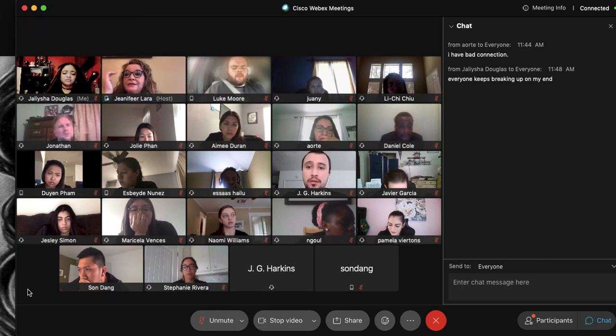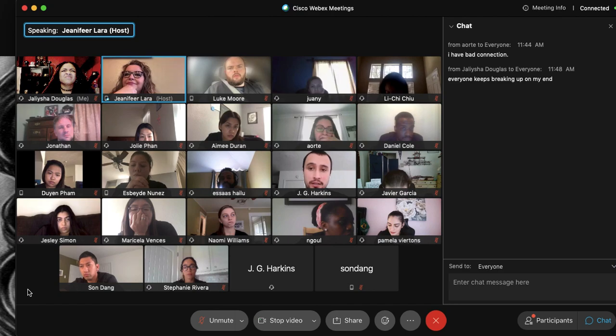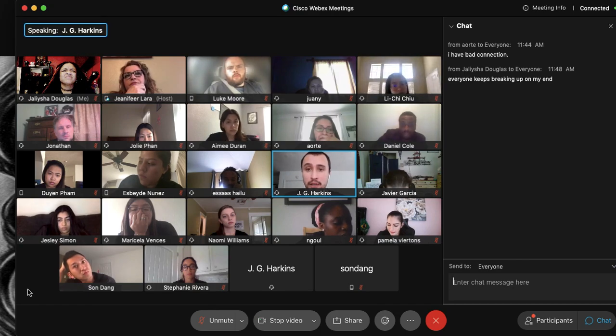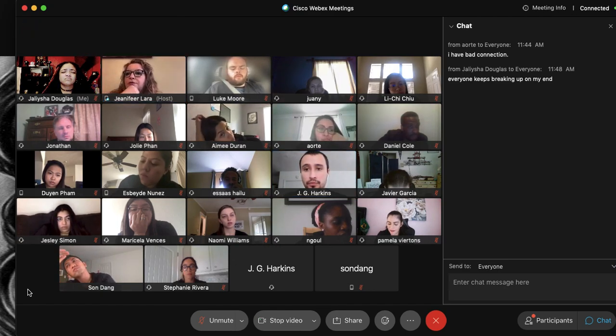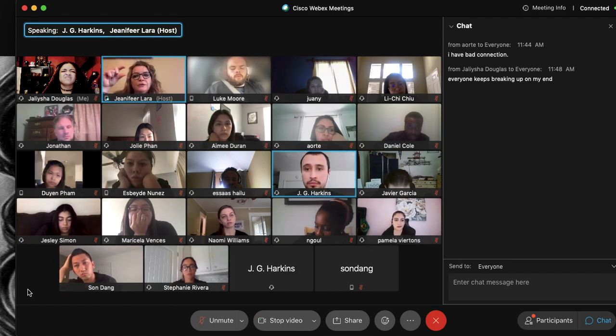Or the filament size. Filament size? I'll go back to filament size. If you're talking about filament size, I know there's two different sizes. Depending on what size IR, what size cassette you're exposing, one's going to have a higher resolution than the other. Which filament size is going to have a higher spatial resolution? The larger one? The smaller one.